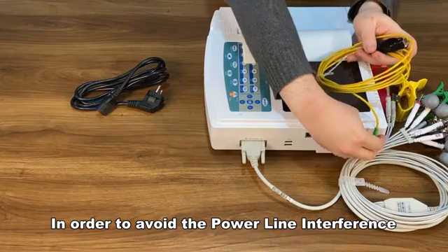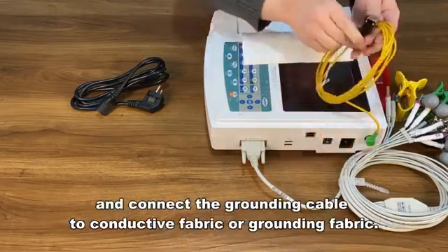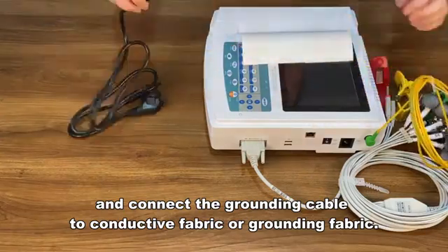In order to avoid power line interference, please plug the grounding cable into the device and connect the grounding cable to conductive fabric or grounding fabric.